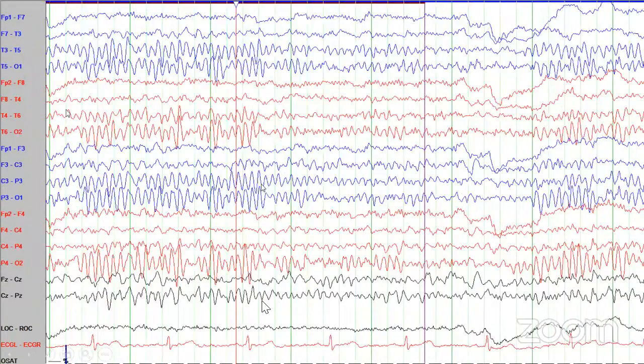Now let's look at this epoch. On first impression, we have a very well established anteroposterior gradient. We have good frequency of the posterior dominant rhythm. But overall, what strikes us is probably this activity, which gives us an appearance as if there is a sharp up deflection and there is some slowing. There is some sharp up deflection and there is some slowing. So is it abnormal? No.